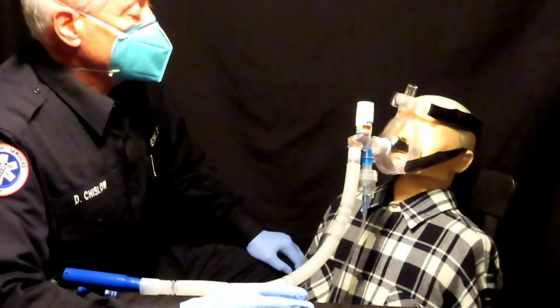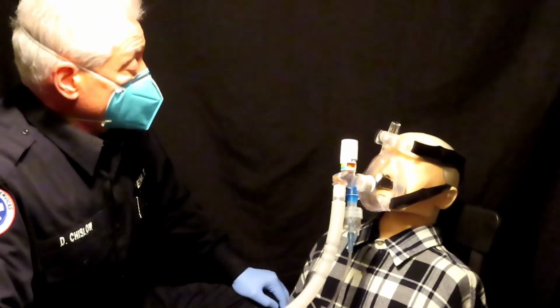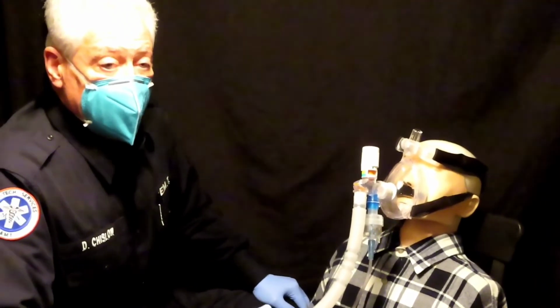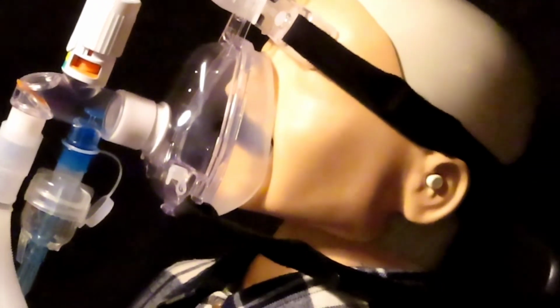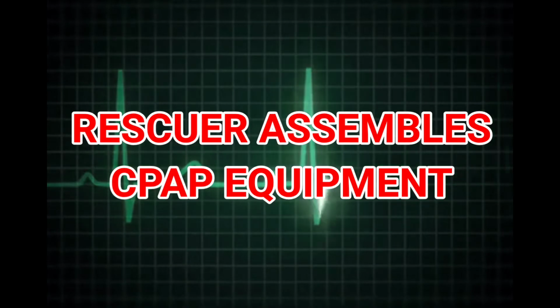Once the mask is in place, ask the patient, "How do you feel? Breathe normally." If the patient becomes anxious or uncomfortable and needs to remove the mask, do so. Once the mask is in place and the straps are applied, check for leaks and adjust the flow rate as necessary.